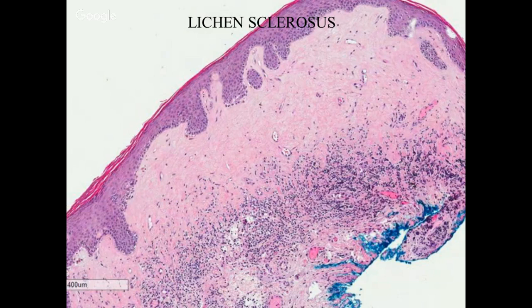The other thing, if you really want to go into differential, amyloidosis might come into the differential, and other things which can look like pink structures actually. But they look very different from lichen sclerosus.